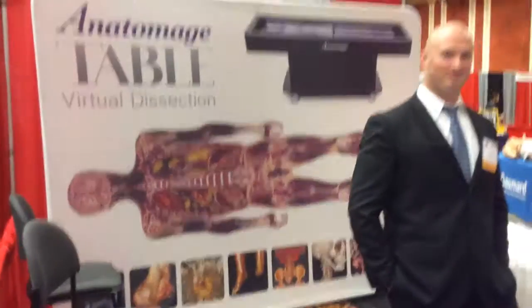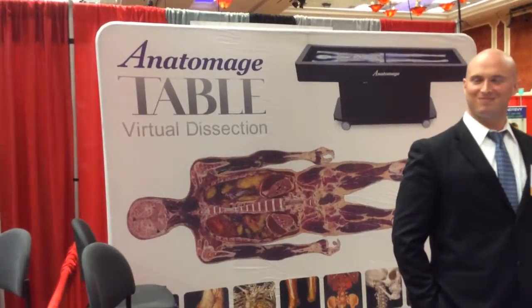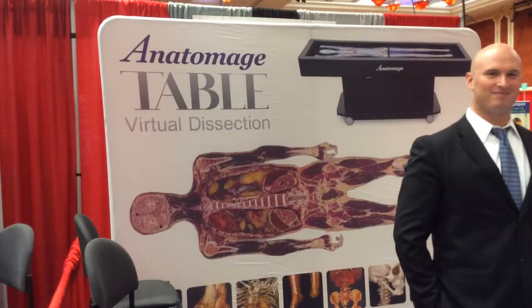I'm at the National Association of EMS Educators Conference, and I'm at the Anatomage table virtual dissection.